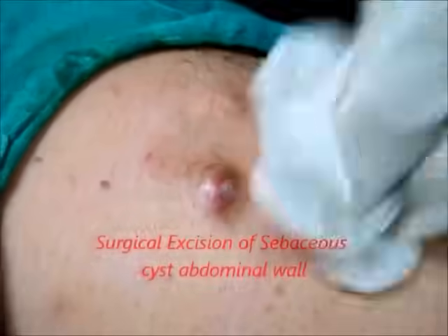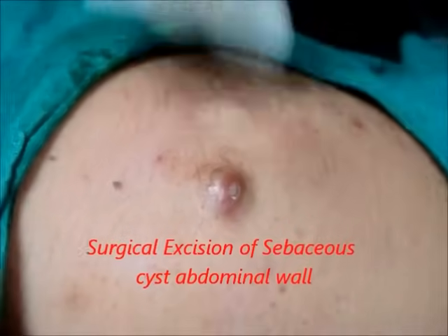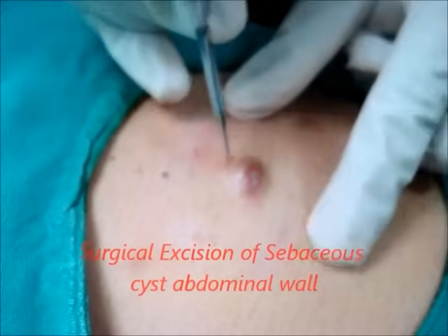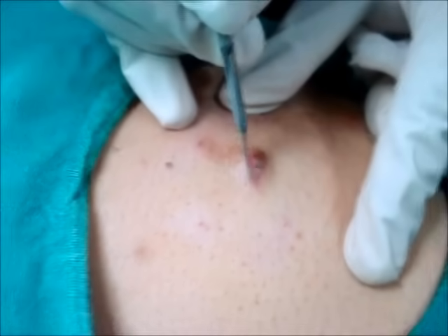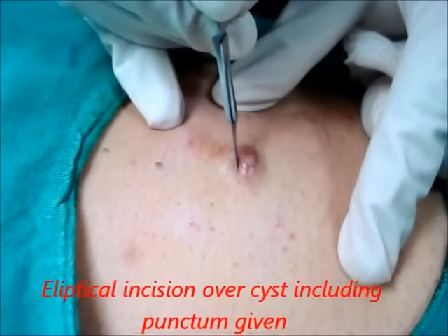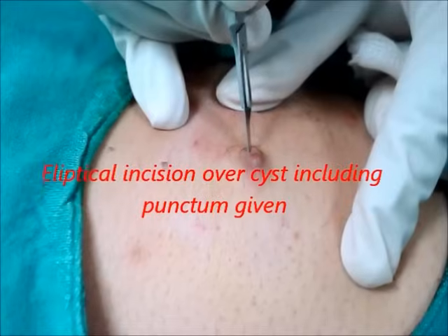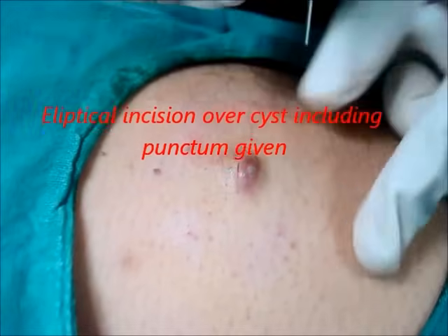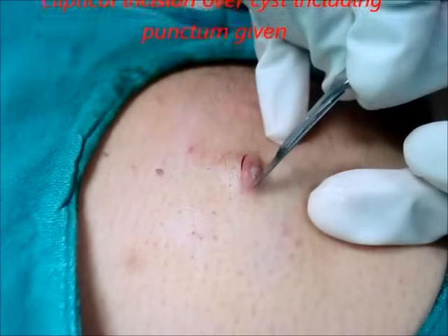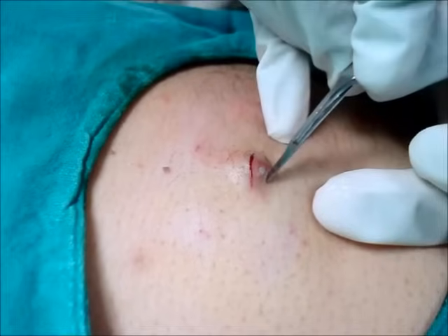Hi friends, this is a small sebaceous cyst in the abdominal wall which is to be removed under local anesthesia. In a previous video I showed the sebaceous cyst in the abdominal wall, and now I am going to show you the dissection.